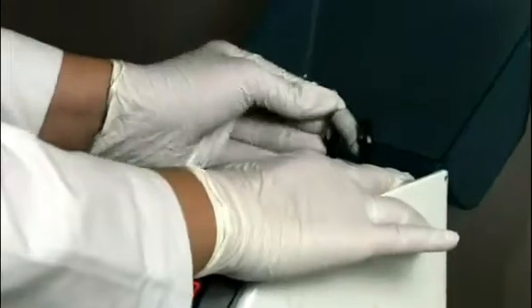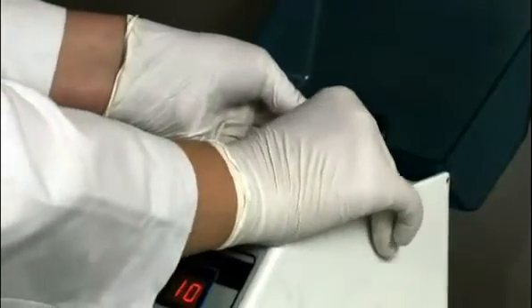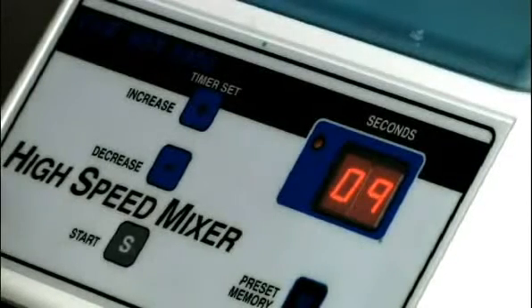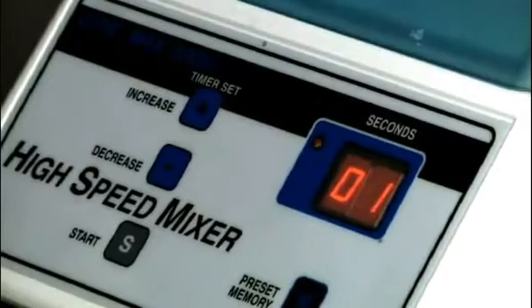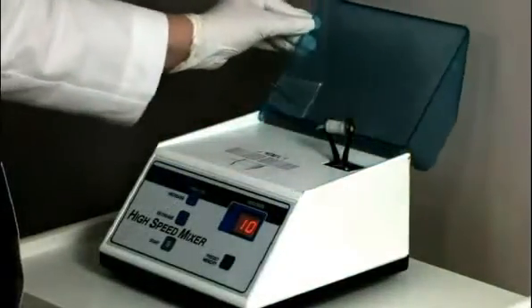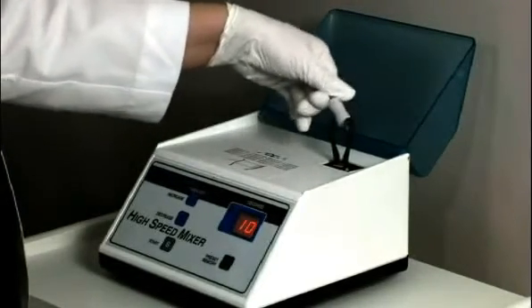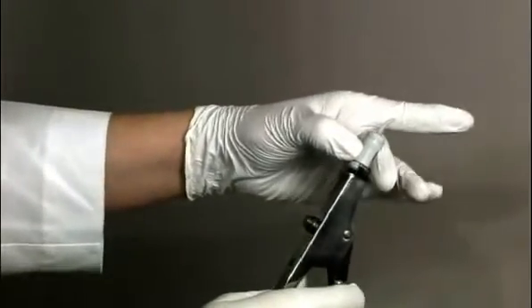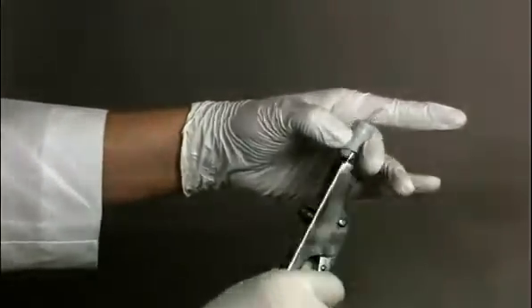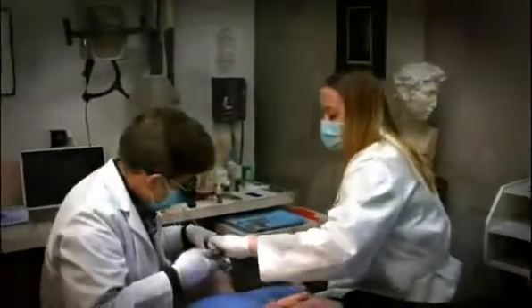Immediately remove the capsule and set it into the high-speed mixer and mix for 10 seconds. Auto-mixing can provide a consistent, smooth mix with less voids than hand mixing while eliminating the potential for contamination. Immediately remove the mixed capsule from the mixer and load it into the GC applier. Make two clicks to prime the capsule and quickly deliver the applier to the mouth.